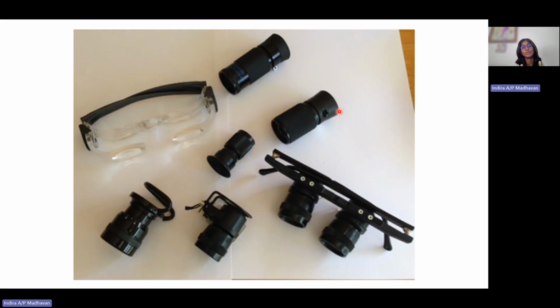So based on that, we will make a decision whether we want to continue with the second assessment, which will be the refraction. If there is a drop in VA, and also if there is improvement in pinhole measurement, then we'll continue with a refraction. Once we do the refraction, if the patient's vision cannot be improved, even after the correction, they should be 6/18. Then only they fall into the category of low vision.